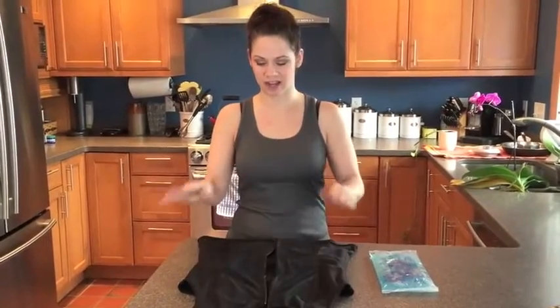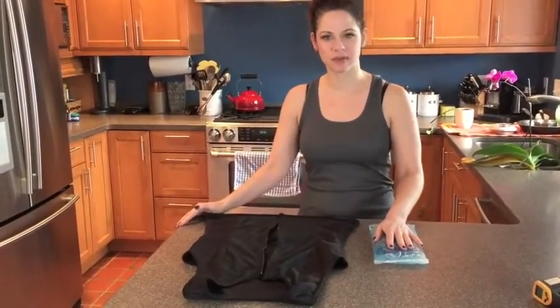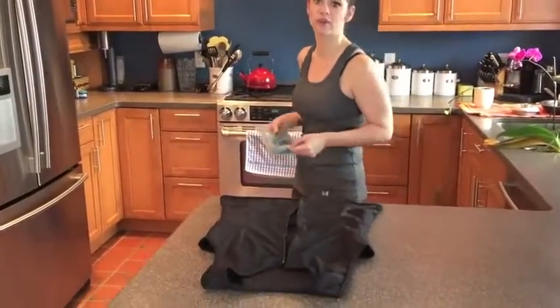Hi there. I want to show you just how easy it is to use the Revive Tank. I've got our tank top right here and our therapy pack here, which can either be frozen for ice therapy or heated up in the microwave for heat therapy. Today I'm a little stiff from sleeping wrong, so I'm going to use heat therapy. I'm going to put this in the microwave for two minutes.